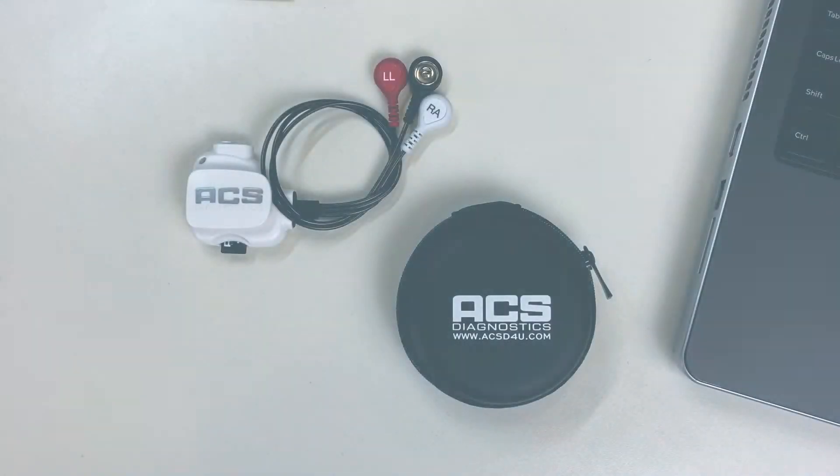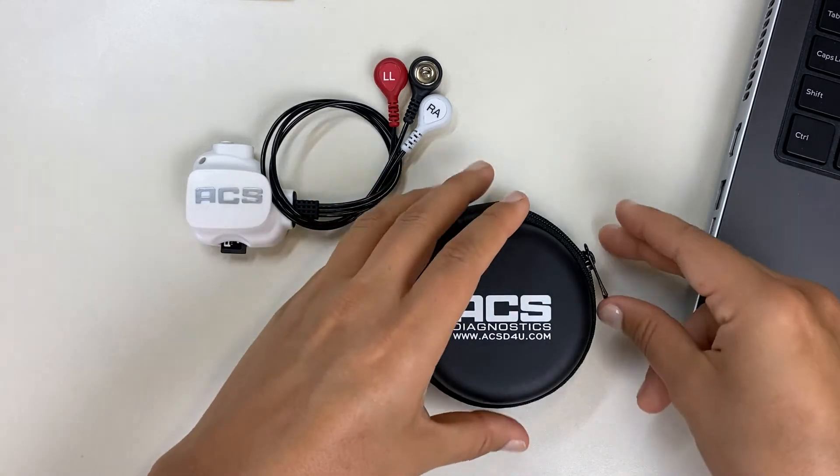This video will demonstrate how to set up the core clip prior to patient hookup. The core clip must be set up prior to hooking up the patient.